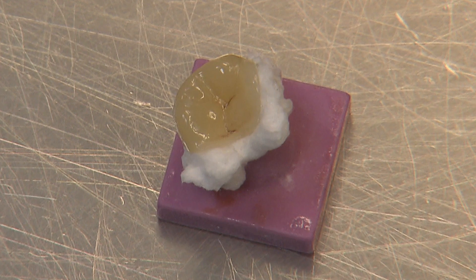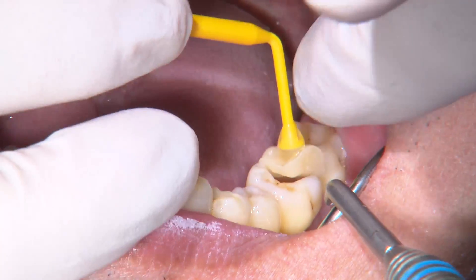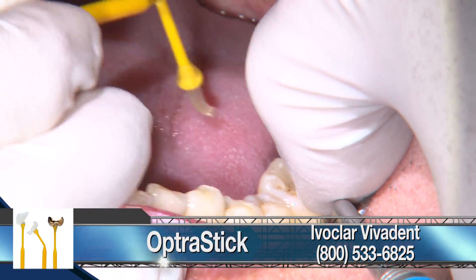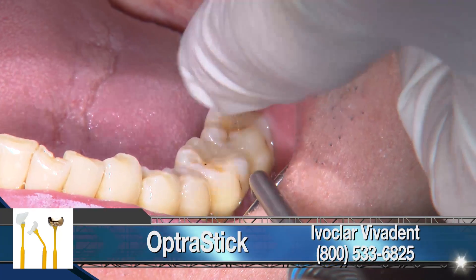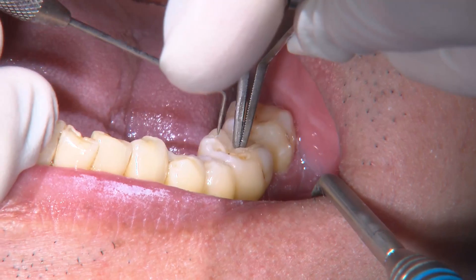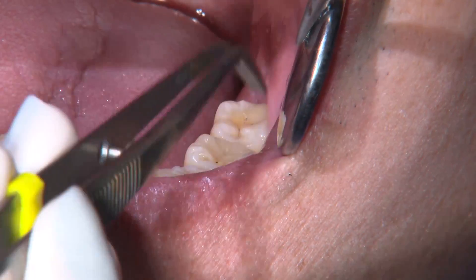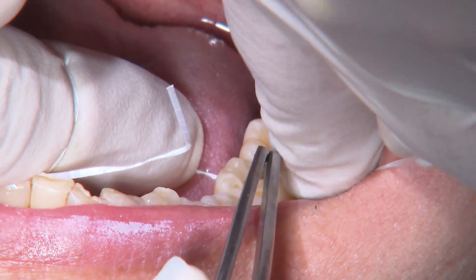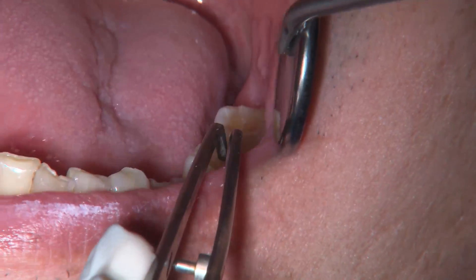The glazed material fuses to the restoration and the stains are set in place. The peg material comes off very easily. This is the first try-in of the onlay in the patient's tooth. I use the OptraStick by Ivoclar to carry the restoration to the tooth. Once it's seated, I verify that the margins are nicely sealed and that the proximal contacts are set properly. I really haven't had to adjust any proximal contacts because once I set it in the software, it is perfect pretty much every time.